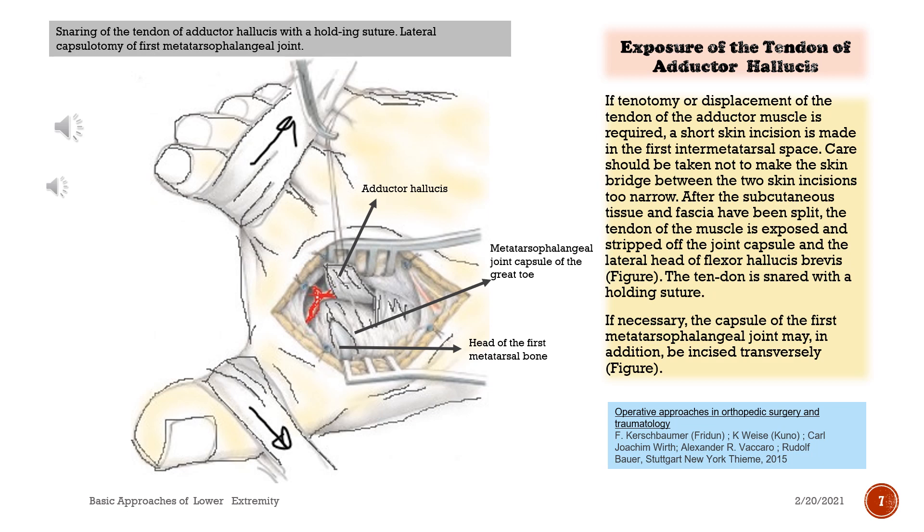Snaring of the tendon of adductor hallucis with a holding suture. Lateral capsulotomy of the first metatarsophalangeal joint.